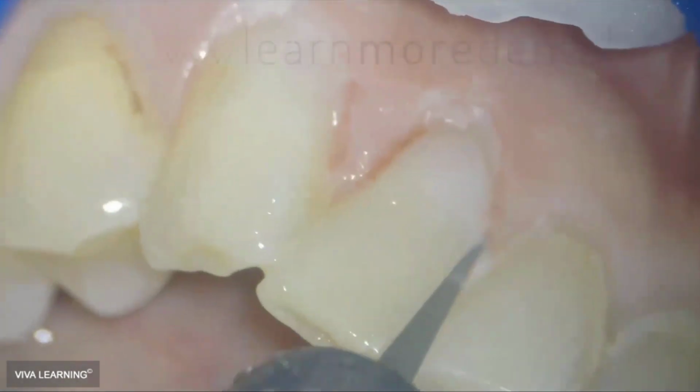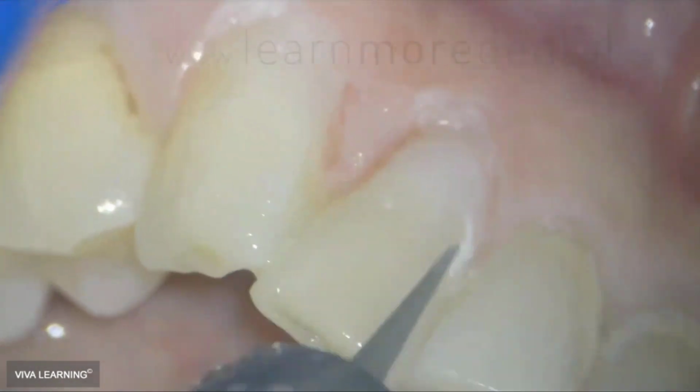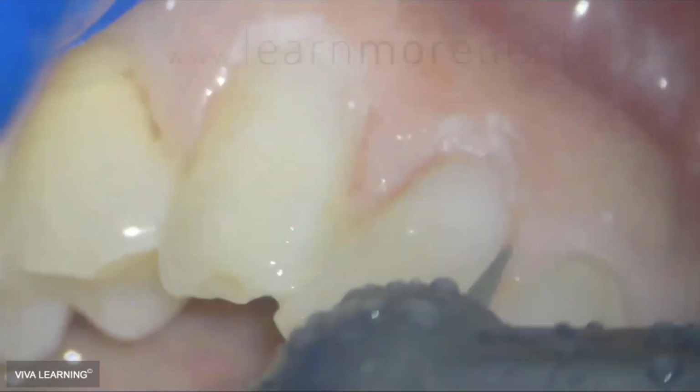Soft tissue only starts to bleed after you're doing your finishing, and you nick the gingiva a few times with your finishing burr.